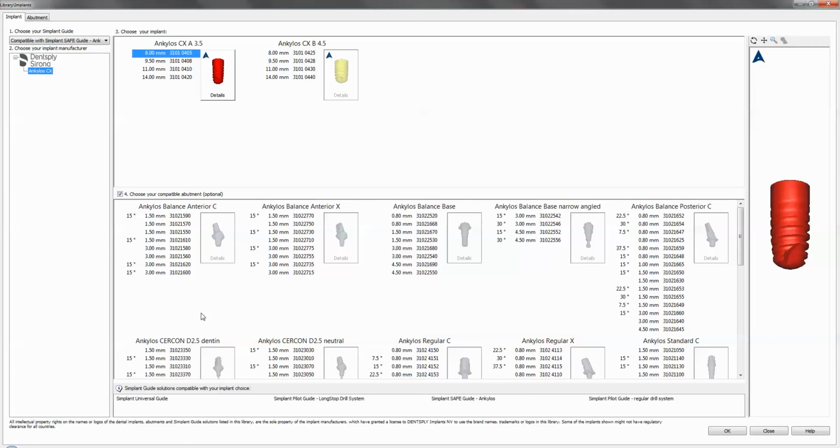And then the opposite effect of having long implants has the other issue of not being able to actually fit the drills in the patient's mouth, because your total drilling length is a lot longer than expected, because you also have to factor in the tube height of the guide. That means longer drills and longer implants cannot be placed in. You simply cannot open the patient's mouth wide enough. So for now, these are the only options that you can work with, between 8 mils and 14 mils.